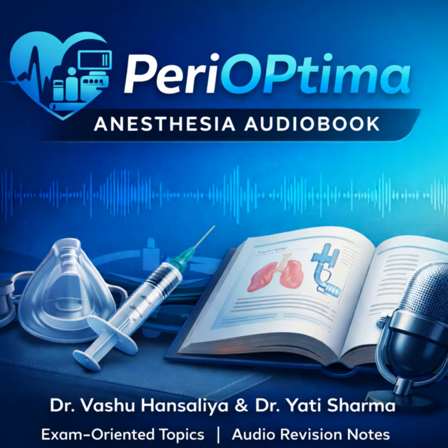Pulmonary edema, fluid in the lungs. You look for B-lines. These are comet tails. They look like vertical, laser-like beams shooting down from the pleura to the bottom of the screen. If you see 3 or more in a single intercostal space, that lung is wet. And pleural effusion. That's fluid outside the lung, in the pleural space. It looks black, anechoic. You might see the quad sign, a square shape formed by the shadows of the ribs in the fluid. Or, on M mode, the sinusoid sign, where the lung line floats like a jellyfish in the fluid with each breath.